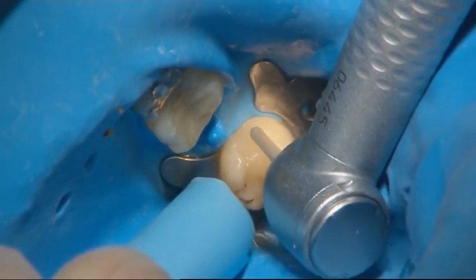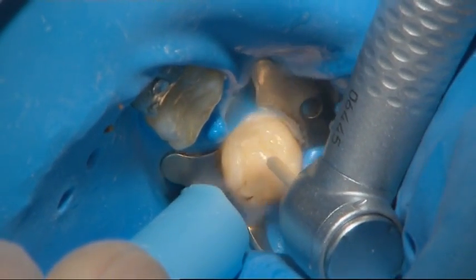Any existing fillings are removed to create space for the fibre frame and layering composite.